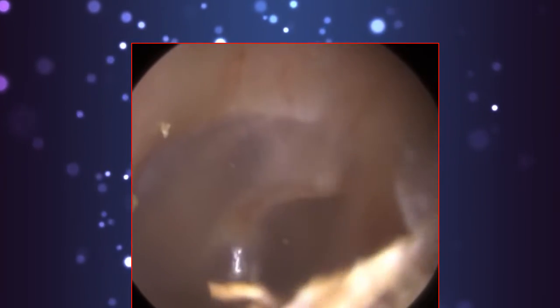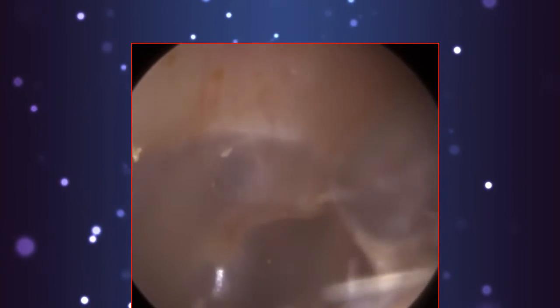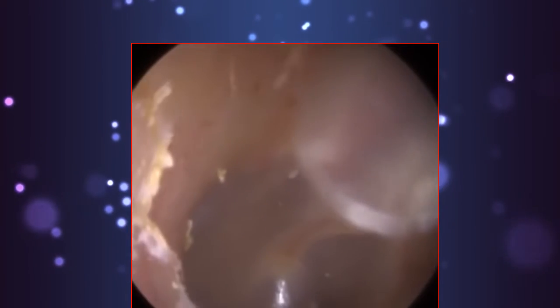But if we're on the inner two-thirds of the ear canal, the bony part, and we start bumping into the canal wall, it can be really, really uncomfortable for the patient. Now this skin is really thick, it's strongly adhered, so I'm just slowly but surely peeling it away. So we're just at the base of the ear canal here and anteriorly. You can see we're just trying to bring this skin together and then peel it.